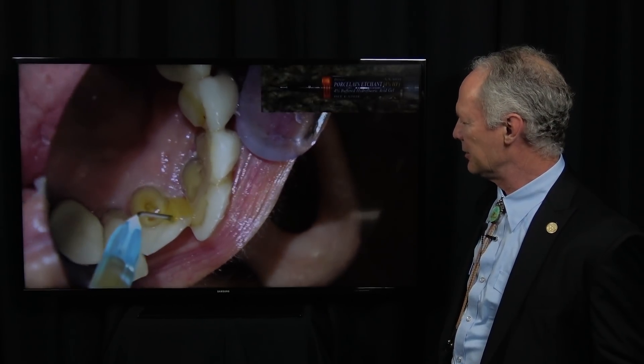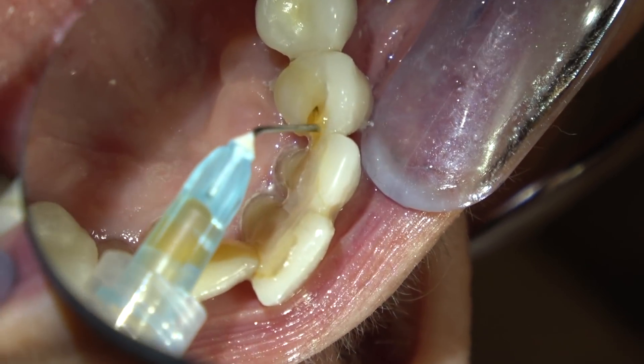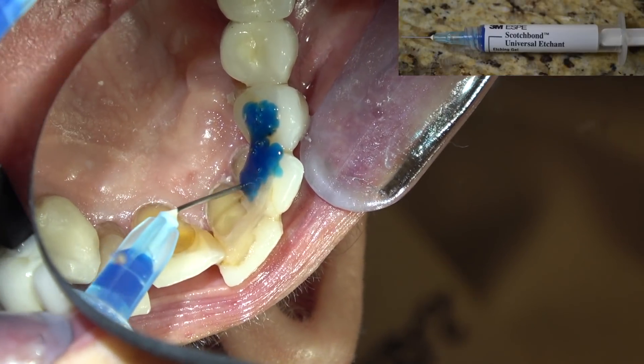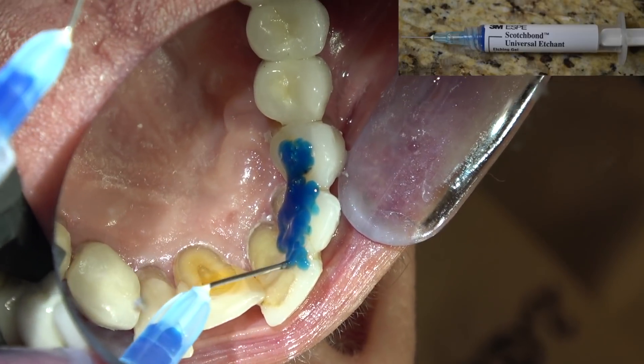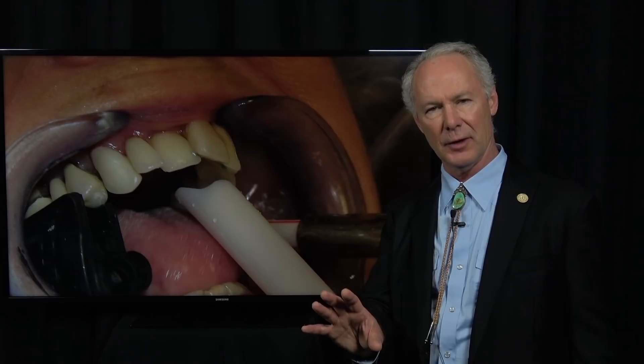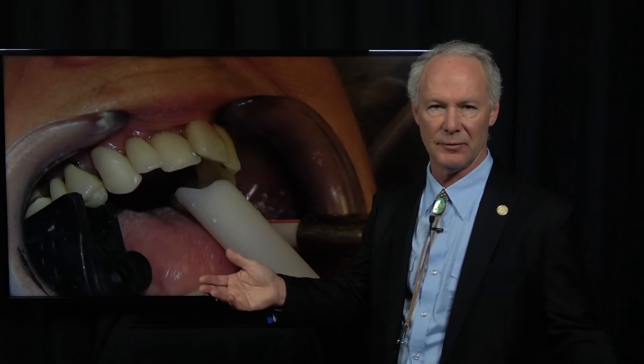Then I'm going to etch the porcelain — because she has some old veneers on these teeth — with 4% buffered hydrofluoric acid. And I'm going to etch the teeth with 38% phosphoric acid. Since there's no dentin exposed, I'll etch the teeth for about 45 seconds. Because I want to etch the porcelain for about a minute and a half to two minutes, I'll place the buffered hydrofluoric acid on the porcelain first, about a minute and a half before adding the phosphoric acid. So I'll leave the hydrofluoric acid on the porcelain for two minutes and on the teeth for about 45 seconds to a minute.